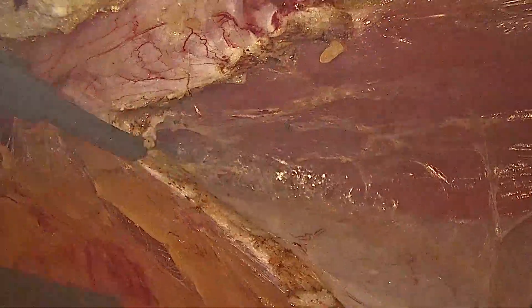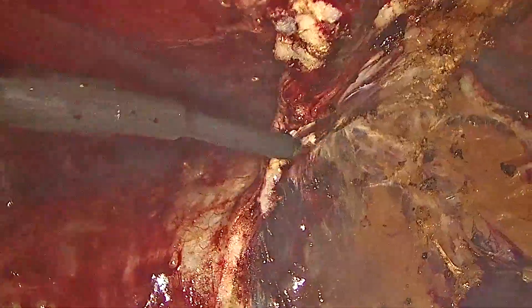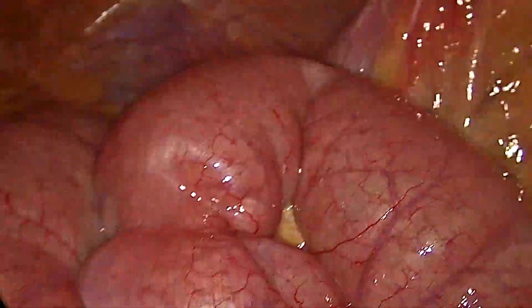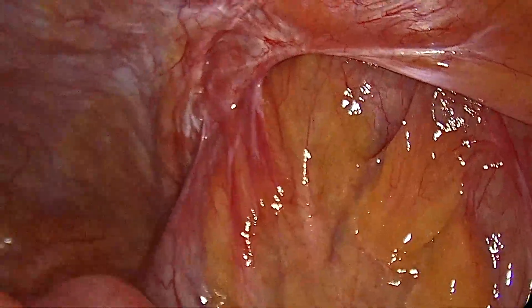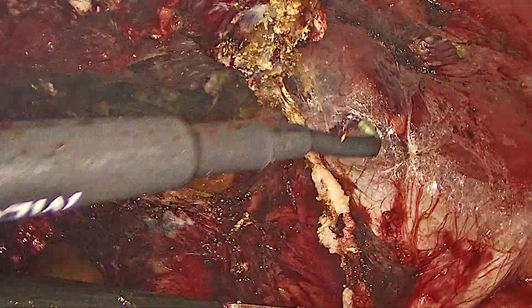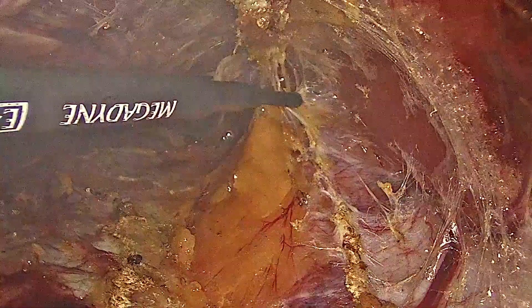We continue our dissection caudally by dividing the medial aspects of both posterior rectus sheaths to reach the extraperitoneal space in the pelvis. We take advantage of a small rent in the posterior layer to assess the hernia defect and its content. We continue on the right side dividing the medial aspect of the posterior rectus sheath to reach the pelvis.